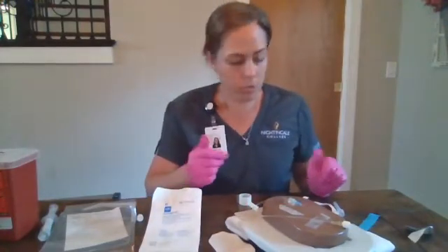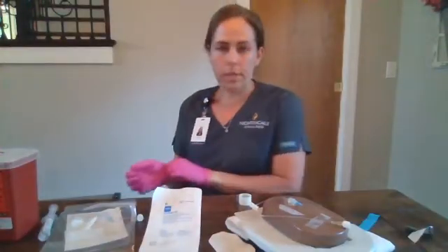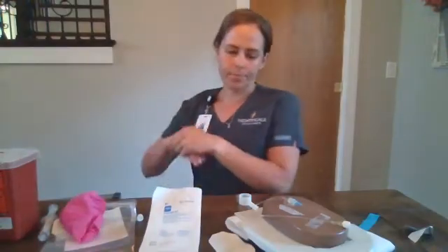We will remove our supplies. Any additional sharps will go in the sharps container. All of the other supplies will go in the trash. Discard our gloves, do hand hygiene, and we'll document that procedure.